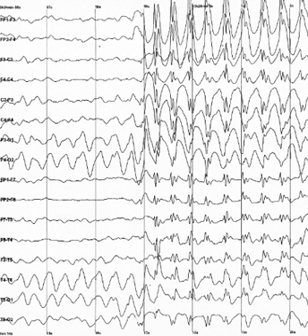Stage 1 sleep, equivalent to drowsiness in some systems, appears on the EEG as drop out of the posterior basic rhythm. There can be an increase in theta frequencies. Santamaria and Chiappa catalogued a number of the variety of patterns associated with drowsiness.